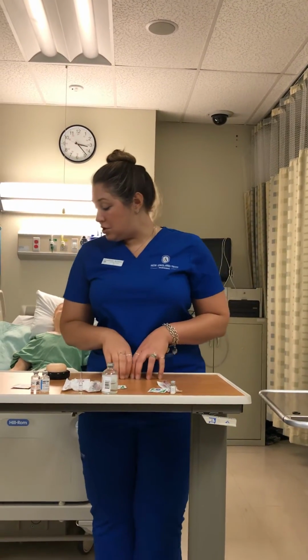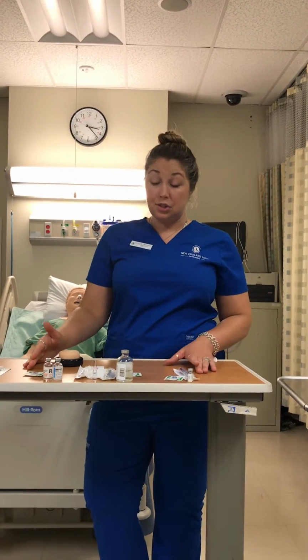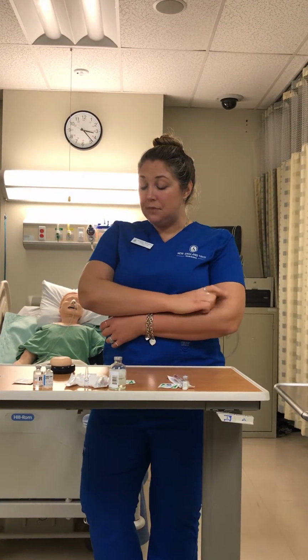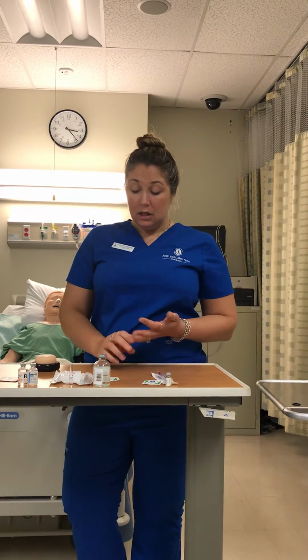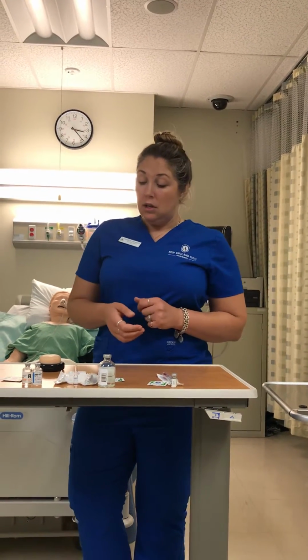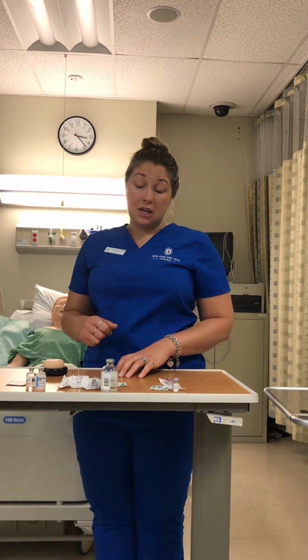Okay, now I'm going to demonstrate different needles to use for different kinds of medications. It depends on the size of the patient. If they're a smaller patient, you wouldn't want to use a gigantic needle. If they're a larger patient, you wouldn't want to use a small needle. Also the site of the injection and the kind of medication that you're giving.